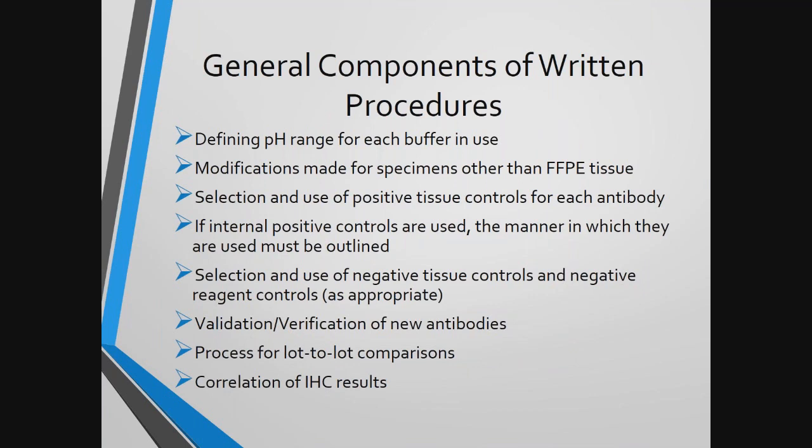How you do this is really entirely up to you, as long as they are done in such a way so as to be useful to your staff. Many facilities prepare one document for every IHC they perform, outlining all the necessary components, and then group some of the more general items into their own policy.